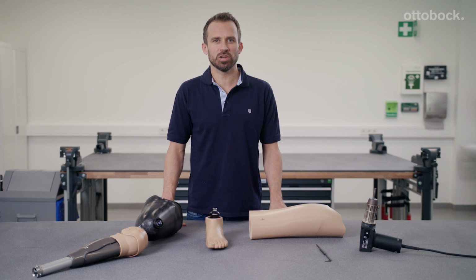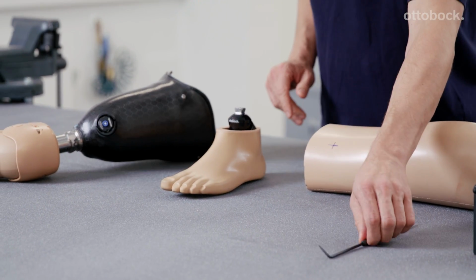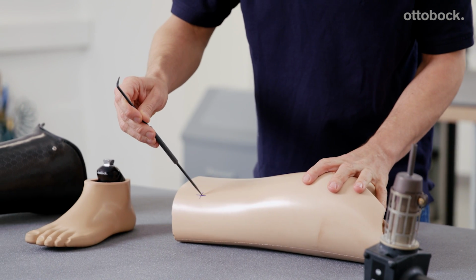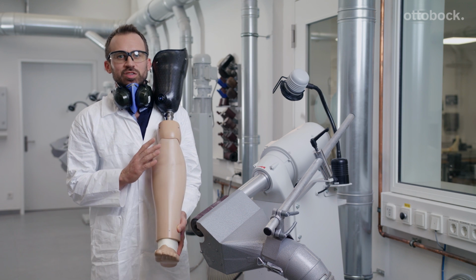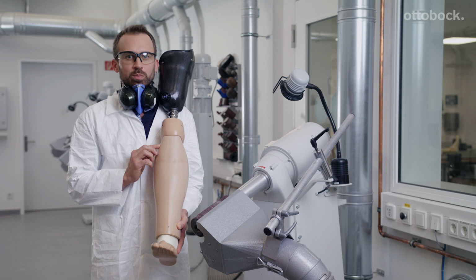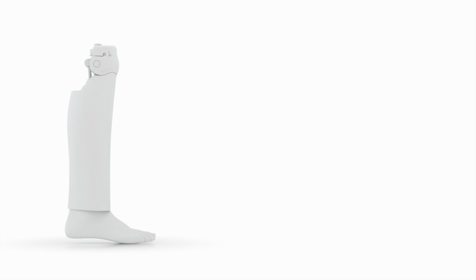Before you start sanding the shape of the shank, you must ensure that you can access the screws. It's best to use a scribing needle, heated with hot air, to do this. Pull on the shortened shank, determine the height of the access holes, and push the hot scribing needle through the foam. The shape of the shank can now be sanded according to your customer's individual measurements. Please note that the upper section of the shank may not be sanded. If it is sanded, the transition between the knee and shank contour will not retain its attractive shape anymore.